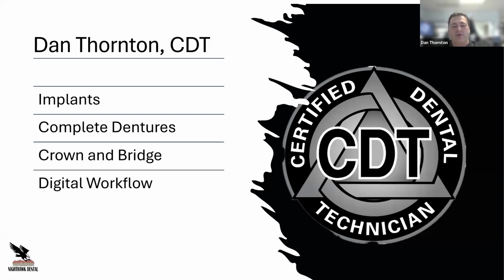I started getting more into the stackables a little bit later on. When you get more into stackables, a technician's not really needed. A staff member can be trained to do the stackable guides. The only issue is if something goes wrong in the surgery and something changed, then they need guidance on how to reset the bite by hand, or what to do with the prosthesis, like opening the holes up or taking a cylinder or two off so we can pick up 2 to 3 cylinders at one time, then come back and pick up the other 3. If the angles are divergent, they'll look to you to be a problem solver and make sure the prosthesis comes out.